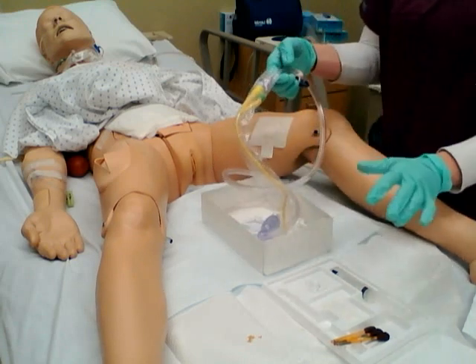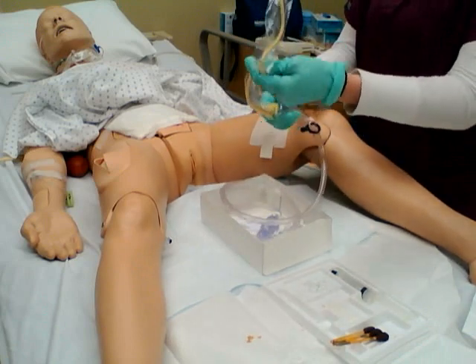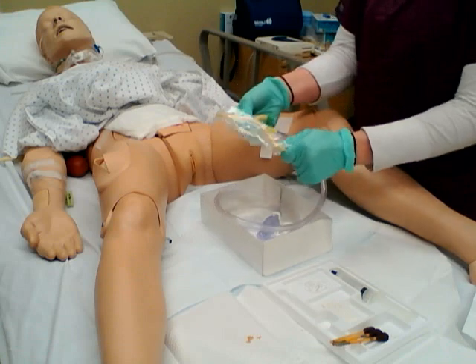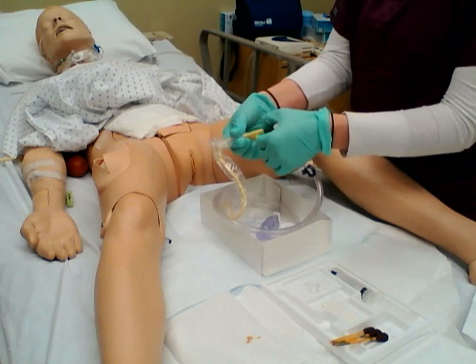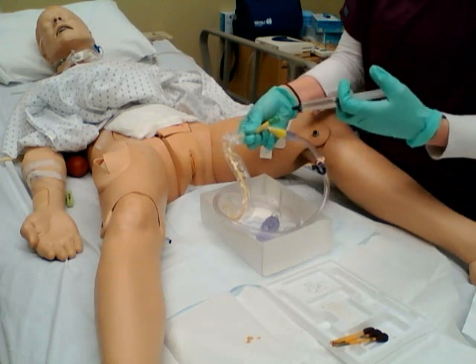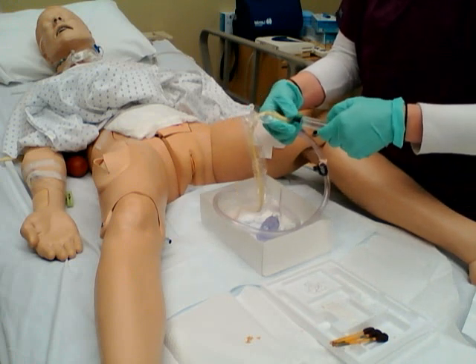So now that everything is all prepped, I'm going to prep my balloon for the insertion of the catheter. Just going to pull back the plastic a little bit, keeping this end as clean as possible. We don't want it to flop out. I'm going to insert about 10 mils of normal saline.